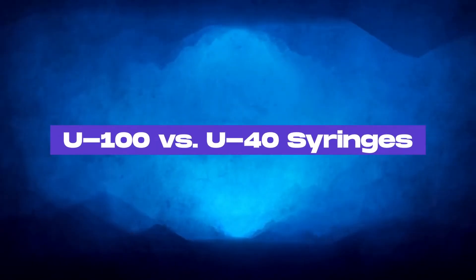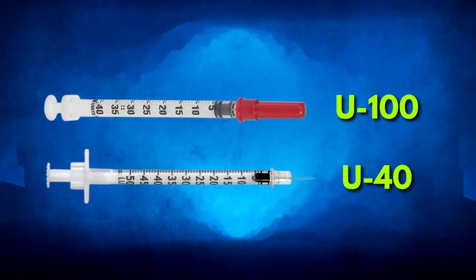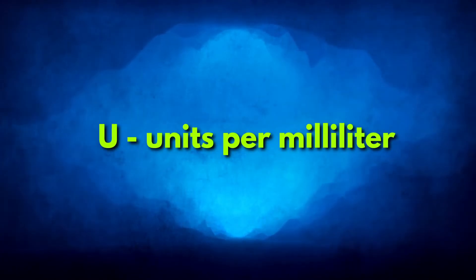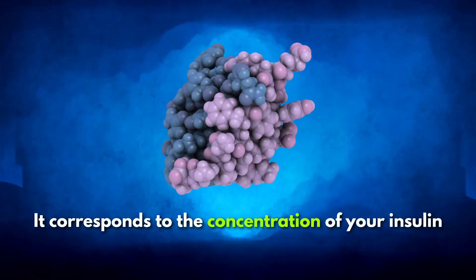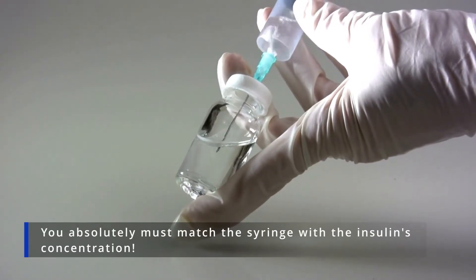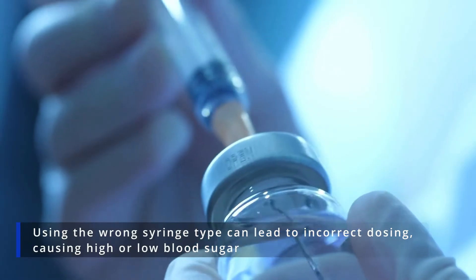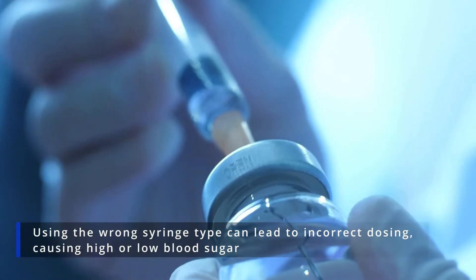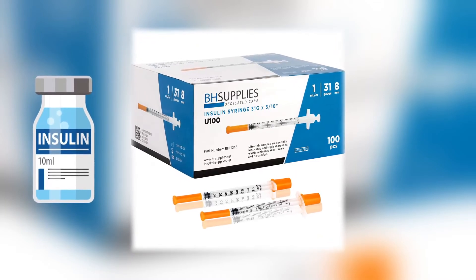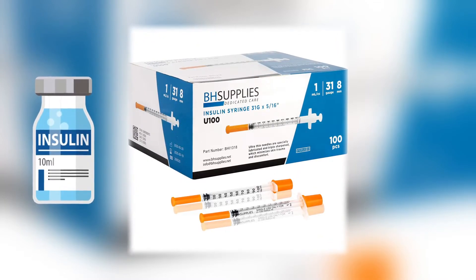The two primary types of insulin syringes are U100 and U40. The U stands for units per milliliter, and it corresponds to the concentration of your insulin. You absolutely must match the syringe with the insulin's concentration. Using the wrong syringe type can lead to incorrect dosing, causing high or low blood sugar. Fortunately, today most human insulins sold in the U.S. are U100.